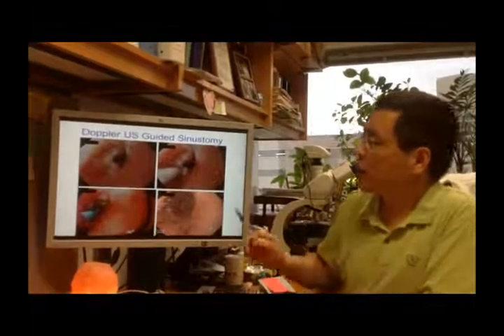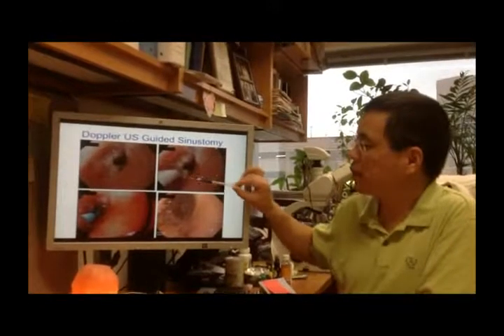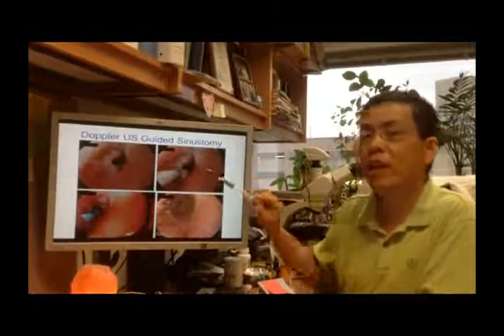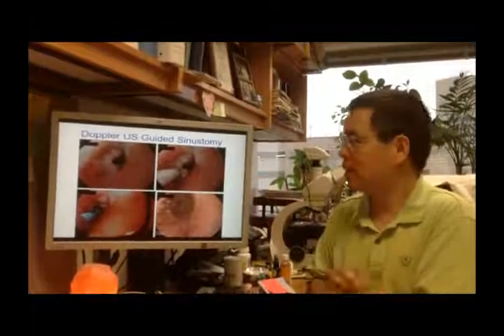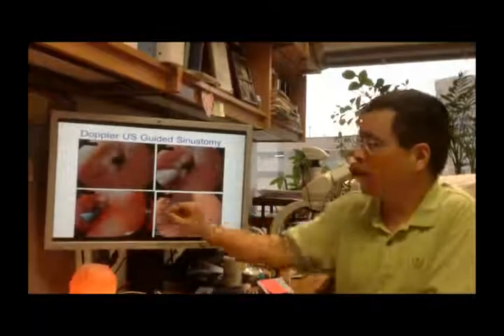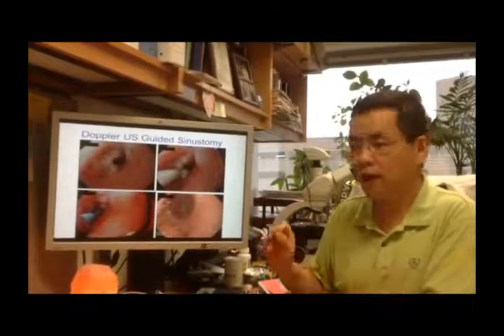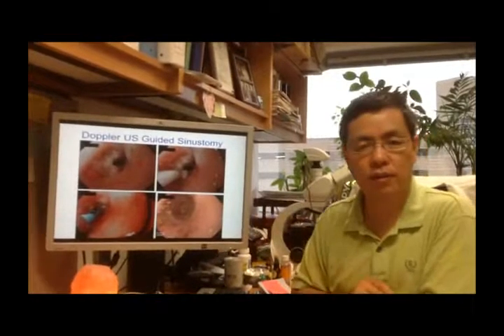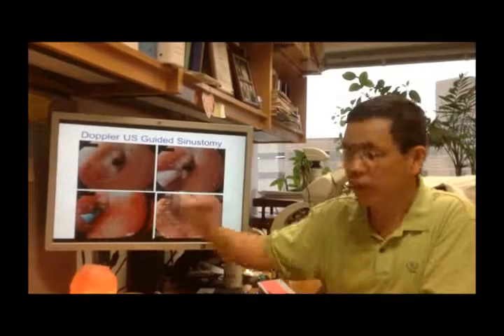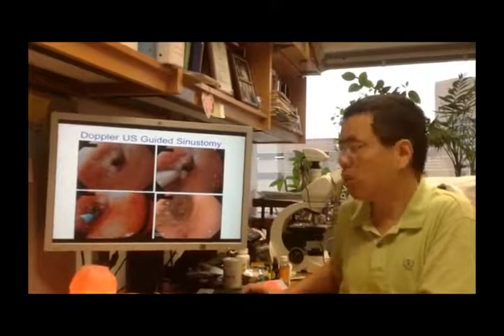Here we use Doppler ultrasound. The purpose of the Doppler ultrasound is to detect areas with rich blood flow — you try to avoid cutting those areas. You find areas with minimum blood flow and then use the needle knife to cut there, reducing the risk of bleeding. After the needle knife cut, we again inject doxycycline or D50.